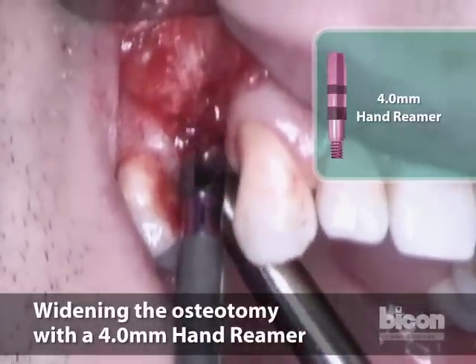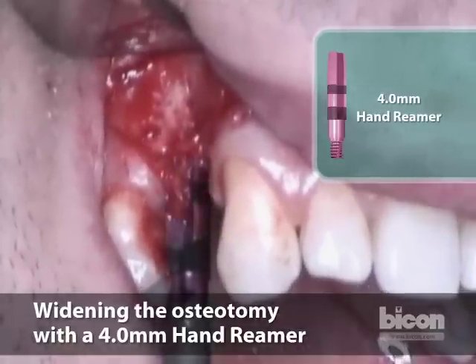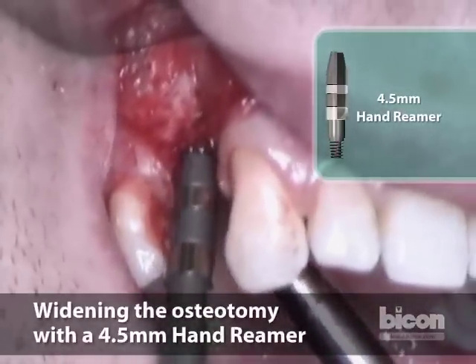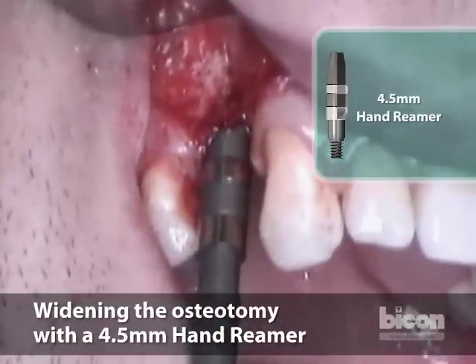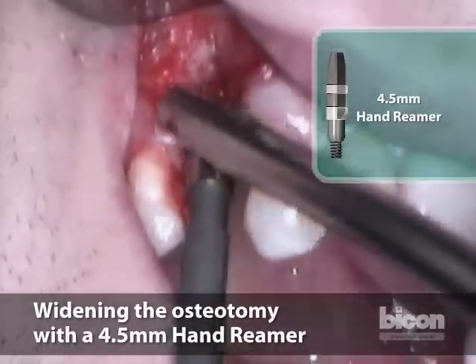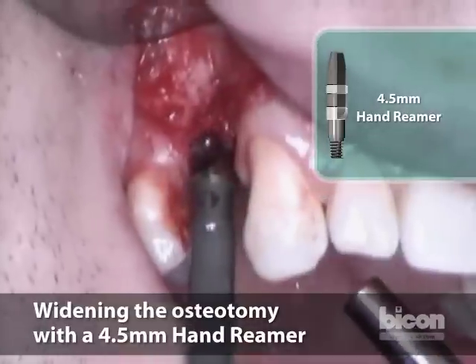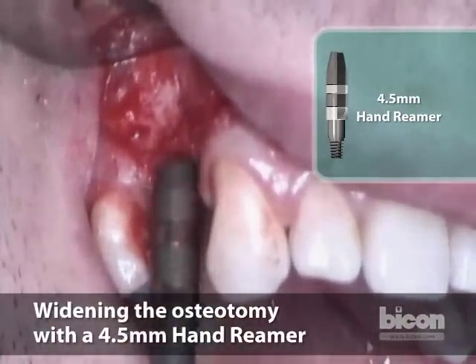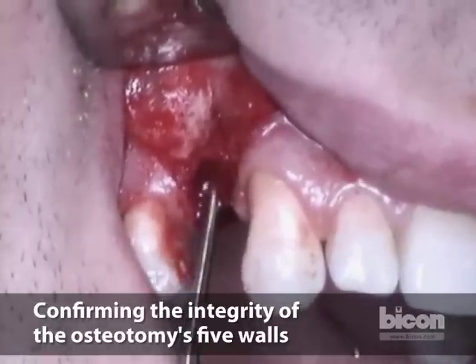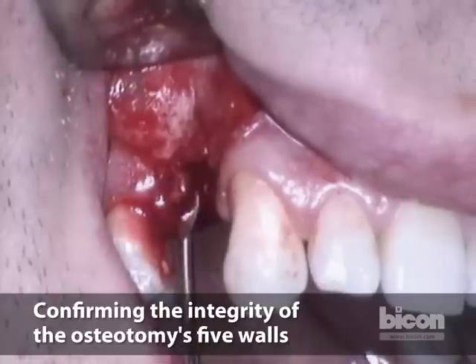That's the whole idea of today's exercise. We knew it was going to splinter, and we're going to go to 4.5 millimeters. You see that the bone is slightly moving. As I design the positioning of the implant, I am taking into consideration that the shoulder of the implant will be placed within the crest — the very top of the implant will be about 2 millimeters from the very top of the crestal bone. There is no opening in the sinus. The palatal wall is intact, the mesial wall is intact and has a spongy, cancellous feel — therefore, we are not violating the bone or getting into the root of the adjacent tooth.